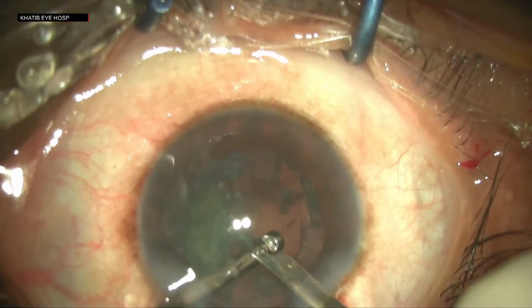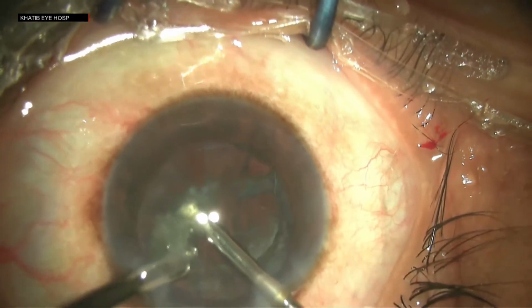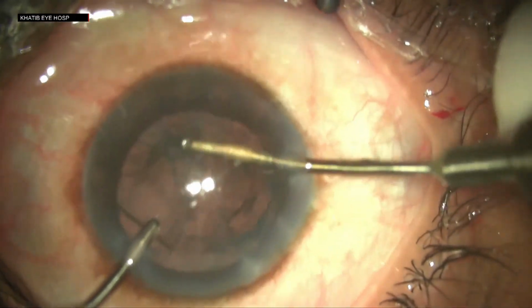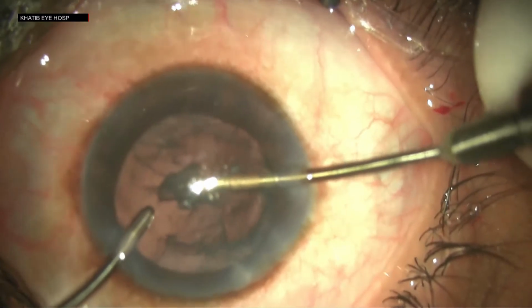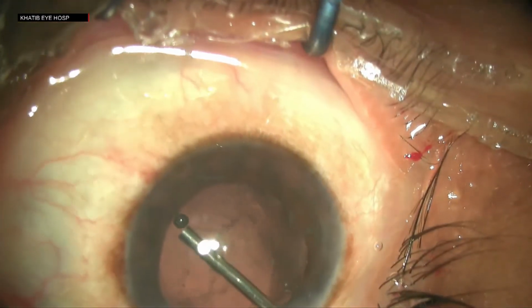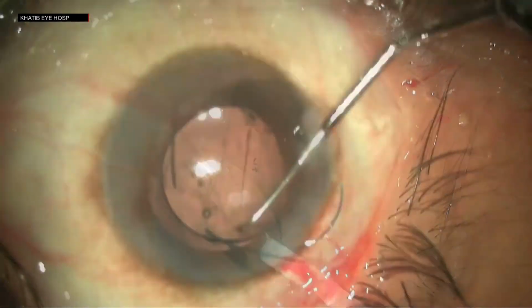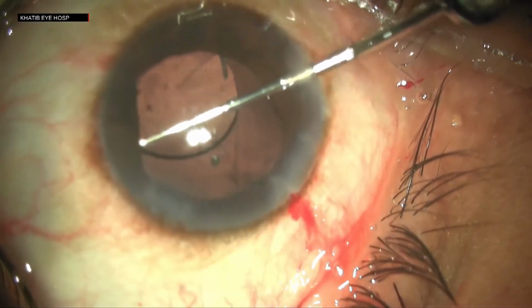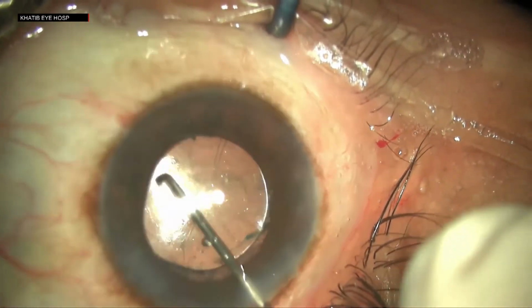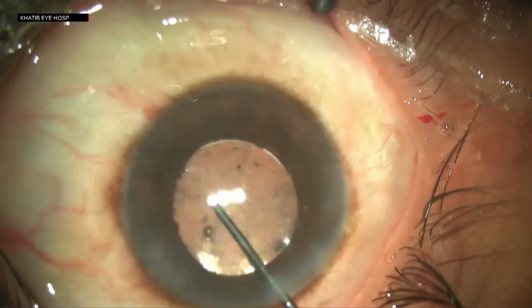Anyways, all the previously mentioned protocols of PCR are followed by me. A thorough anterior vitrectomy is being done, and with the vitrector, the remaining part of the nucleus is removed. Cortex aspiration is done. Finally, a 3-piece monofocal IOL is being placed in the sulcus. Since the rhexis was a well-centered 5.5 mm, a posterior optic capture of the rhexis is being done, as can be seen by the cat's eye appearance of the rhexis margin.